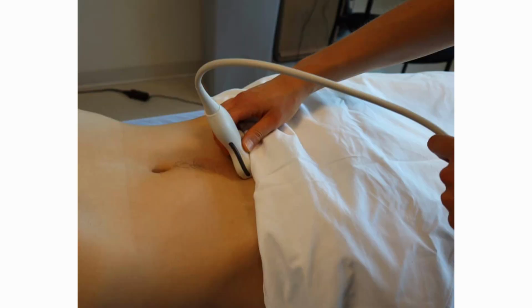Now the final view on the FAST exam is the pelvic view. And this is going to look for fluid within the bowel or surrounding the bowel and surrounding the bladder. This view may be one of the harder ones to get in the craft, depending on what craft you're in and what your position is, but you really want to get right above the pubic symphysis.